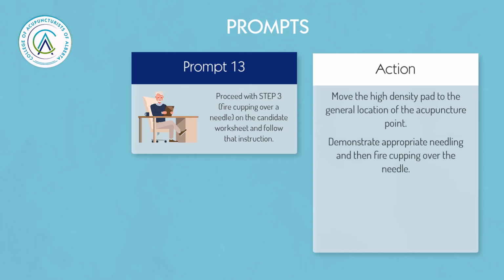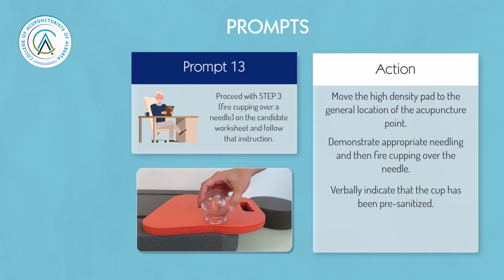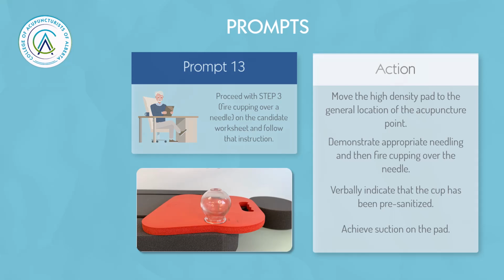Demonstrate appropriate needling and then fire cupping over the needle. Verbally indicate that the cup has been pre-sanitized. Proceed with demonstrating fire cupping over a needle. To successfully complete this step, candidates must achieve suction on the high-density pad. Ensure to follow best practices for fire cupping safety.